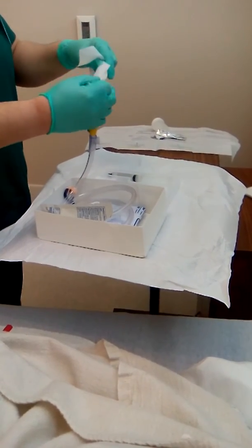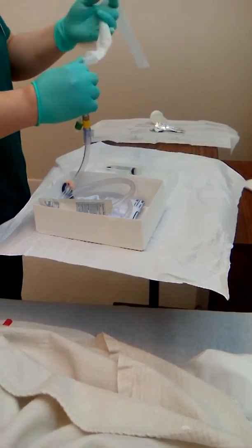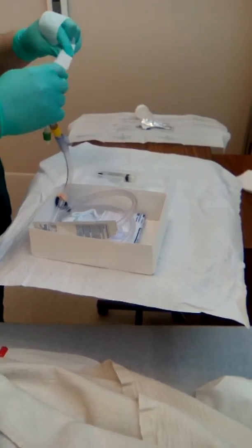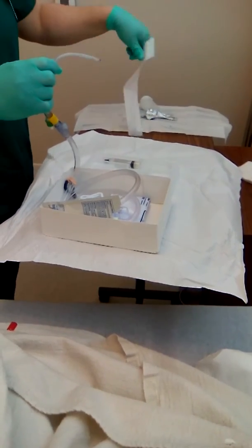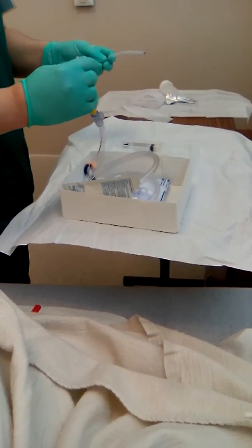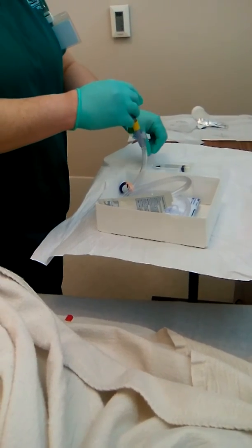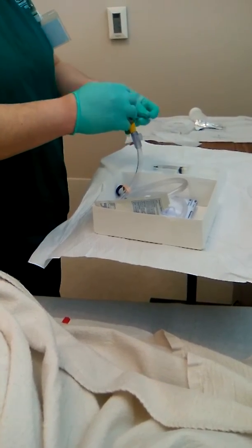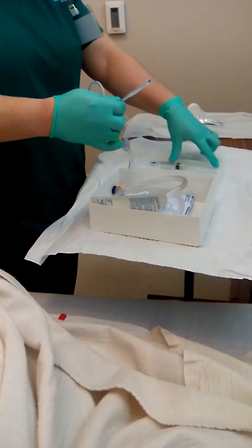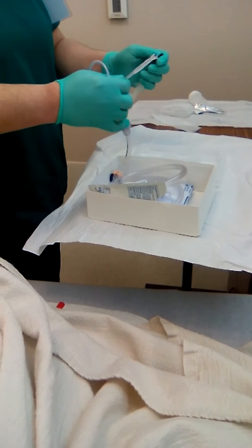As I coil it into my hand, I will lubricate the catheter 1 to 2 inches for a female, 5 to 7 inches for a male. At this time, I am also going to connect my sterile water syringe for inserting my balloon.